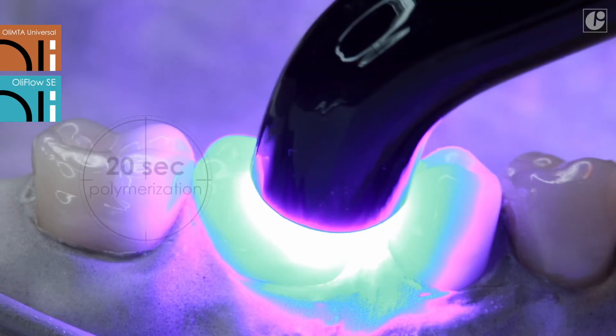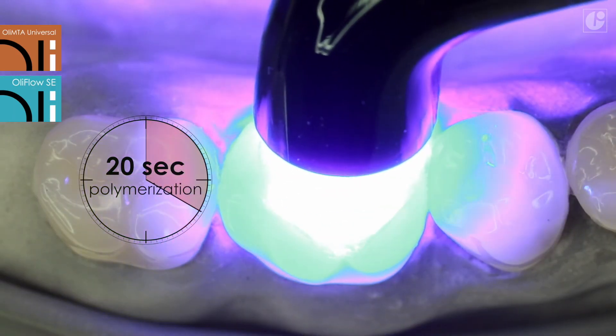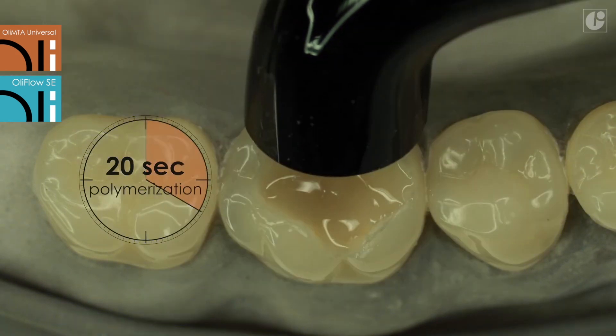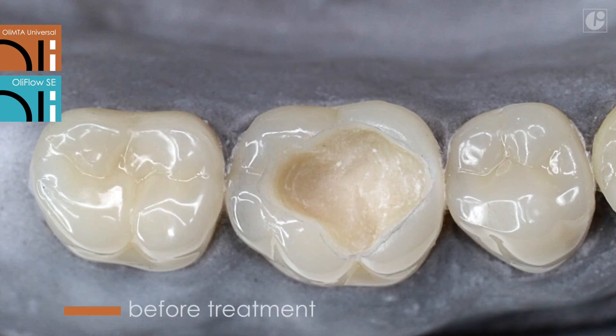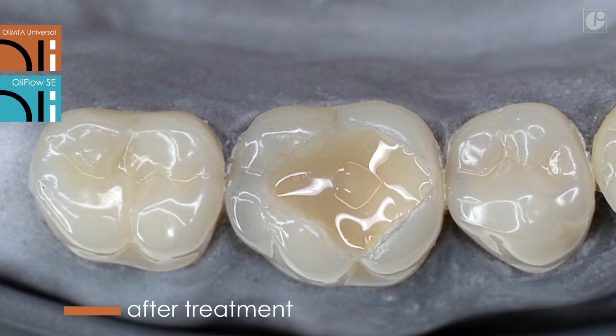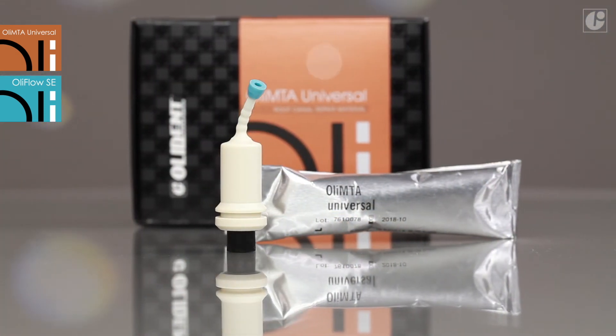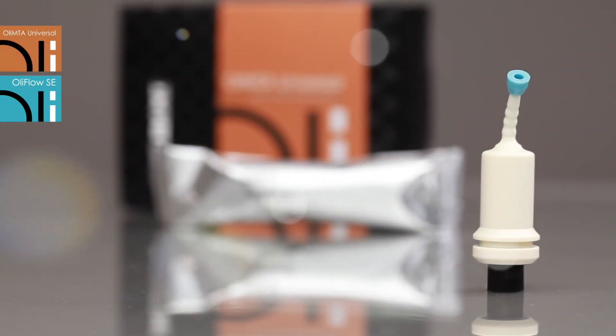OliFlow SE should be finished with a selected composite material, for example VIP Posterior Micro Hybrid Composite Material for Posterior Teeth. Thanks to convenient packaging and application, OliMTA Universal is getting increasingly popular among users. It initiates healing as well as stimulates cementogenesis and bone reconstruction, hence it can be applied in many endodontic procedures.